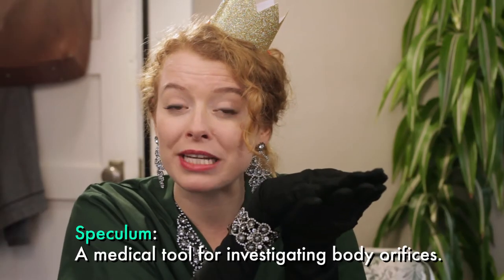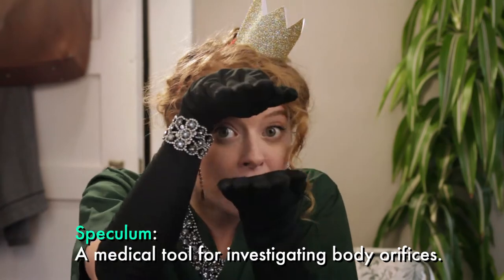The speculum has received a modern update. You might be asking, what the heck's a speculum? Well, it's that little duck-bill shaped instrument the doctor uses to see inside your vagina. If you've ever had a pap test or a pap smear, you've had a speculum inside you.